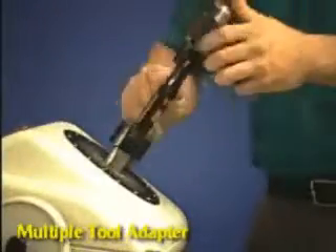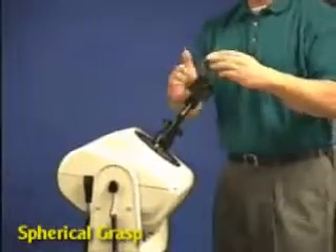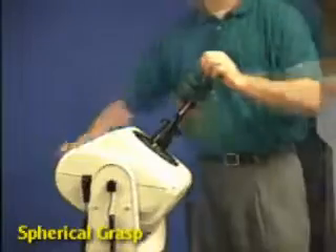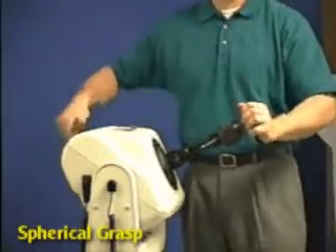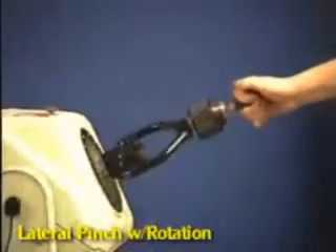Install the multiple tool adapter to the dynamometer shaft. By installing different knobs to the adapter and adjusting dynamometer height and tilt, you can simulate a wide variety of work-related tasks.